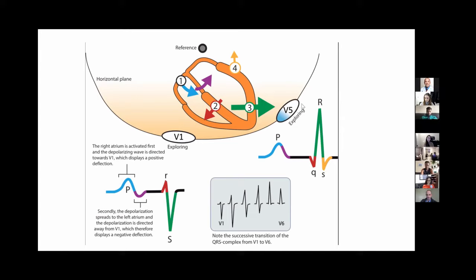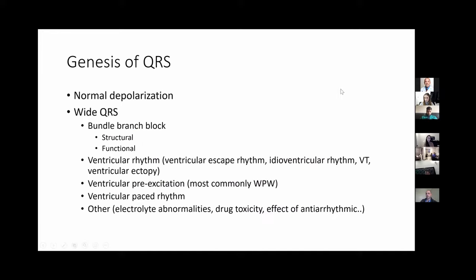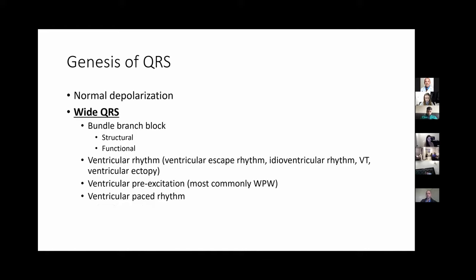Ventricular. Okay, and then you have ventricular, right? And anything else? Afib with variable block. Okay, so you're all on the excellent, that's a good way of thinking. So I'm going to summarize that now, right? So all these things that you were talking about are very limited possibilities.